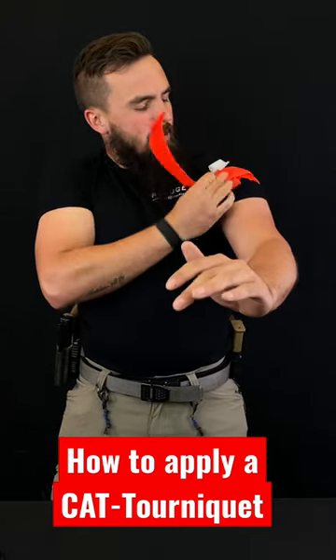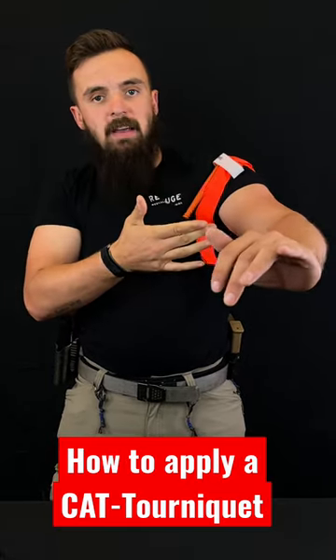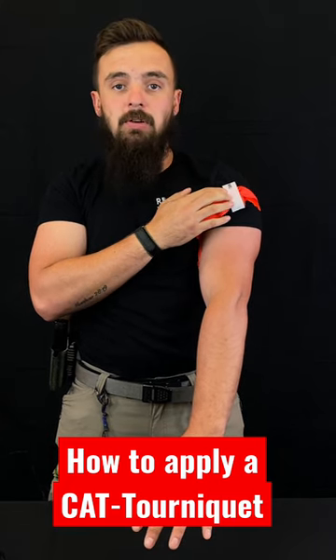After that we bring our tail back through our C-clamp like so, and that's when we can then apply our time tab. Remember to record the time so that way EMT and higher level care professionals always know what time you applied the tourniquet.